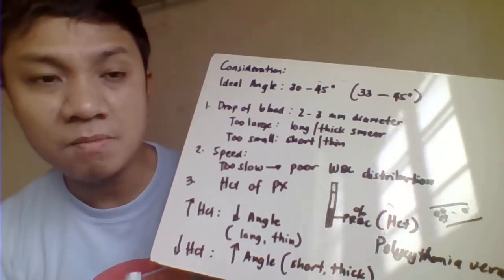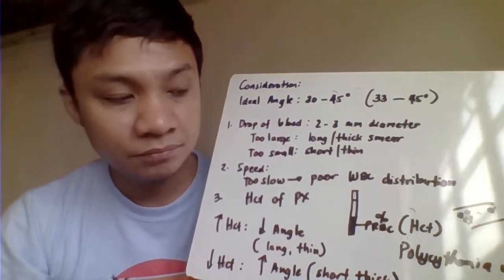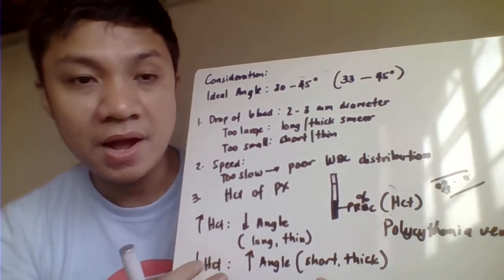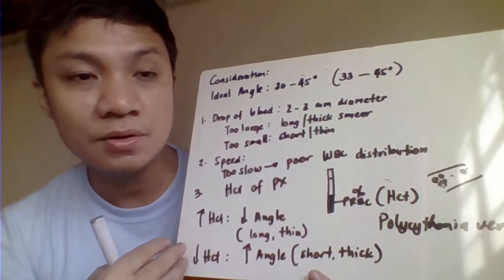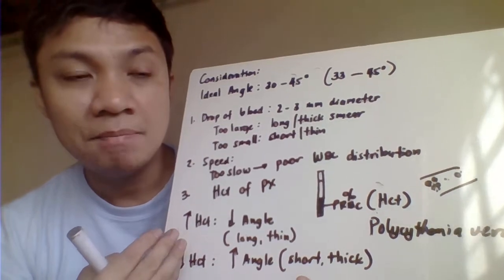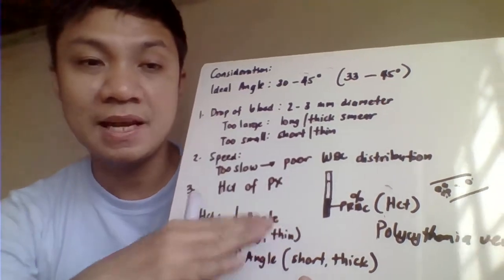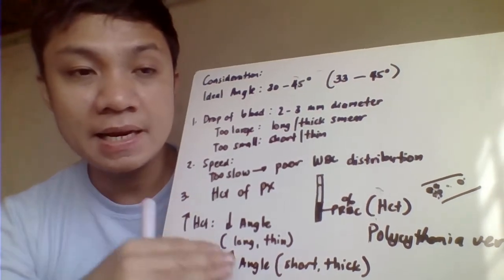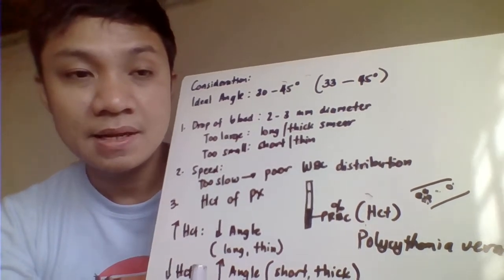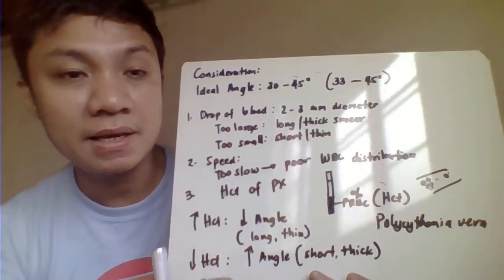What will be the problem when our cells overlap? When you are identifying the different cells, or for example when you are doing a manual platelet count or even a differential count, if they overlap, you could not clearly identify the cells. Like in the case of the platelets, remember the platelets are very small.